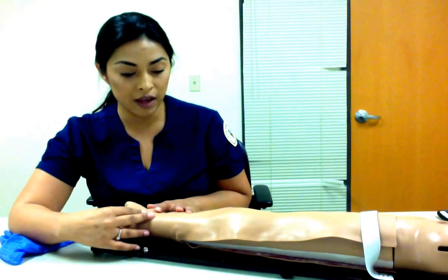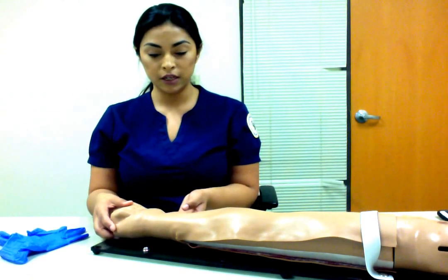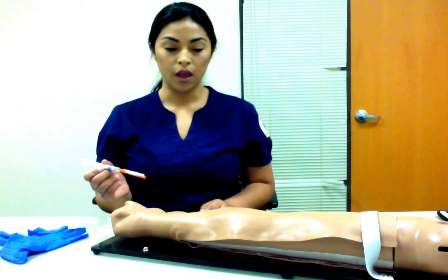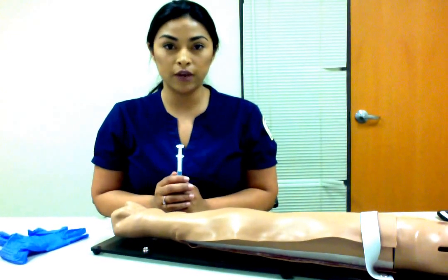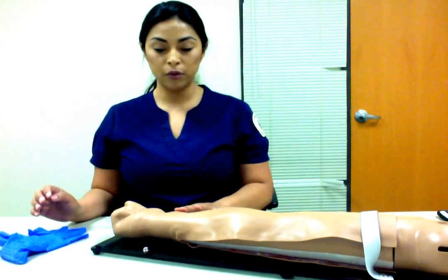Once you have a positive Allen test and the patient's arm is hyperextended, you would go in at a 45-degree angle. Or if you're using a brachial artery, it would be a 60-degree angle. A femoral artery would be a 90-degree angle. You would then feel the pulse with your fingers.